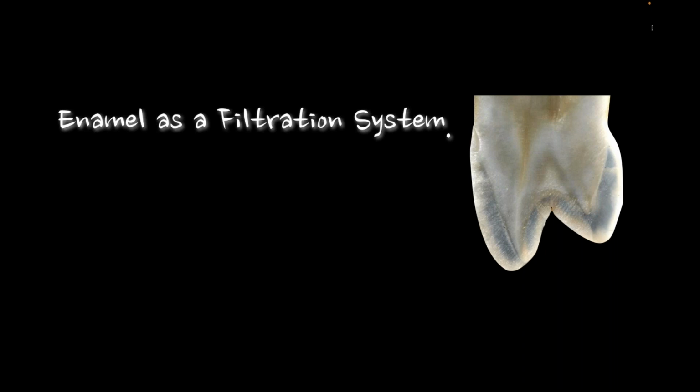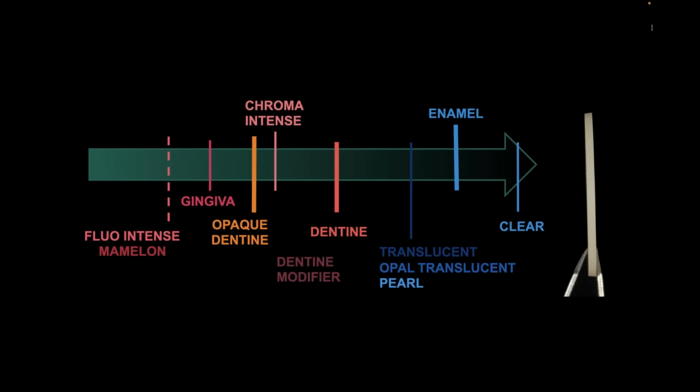And what I'm trying to do is figure out how I want to filter the light in or out of my restoration. I want to be clear about how I say that, because some of you have probably spent some time with me over the years, in webinars or courses, where I've broken down the opacity of the dentins we use, the opacious dentins, and some of the fluorescent materials. The more translucent we get, the more light can penetrate through that material. As I get to the enamels and the translucents, they become very translucent.